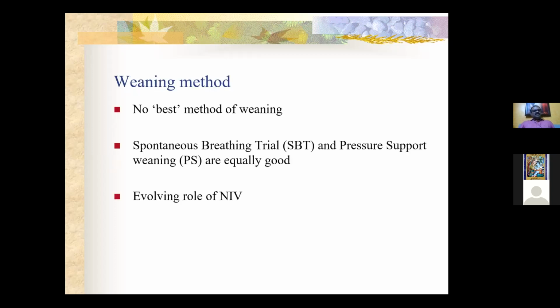There's no best method, but definitely spontaneous breathing trial and pressure support ventilation are very good. So basically what we nowadays use is ACMV. First we start off ventilation with an ACMV, then go to pressure support ventilation and give a spontaneous breathing trial, or even NIV, non-invasive ventilation. We directly extubate the patient from pressure support ventilation without even giving a spontaneous breathing trial.